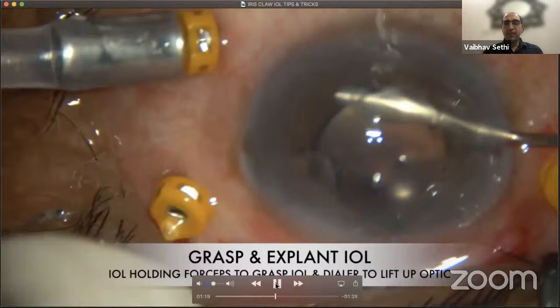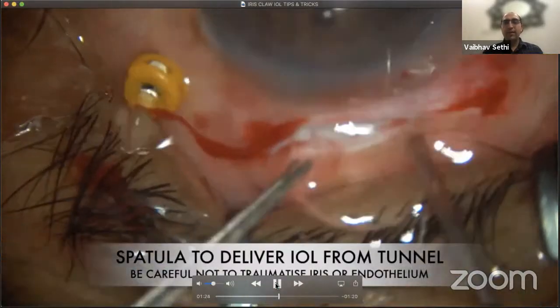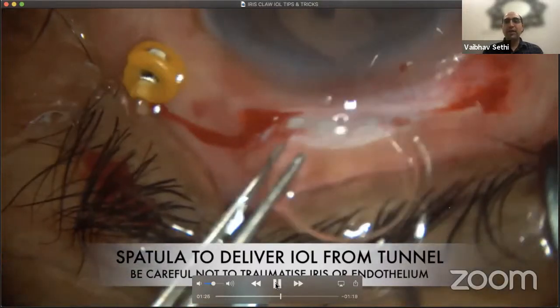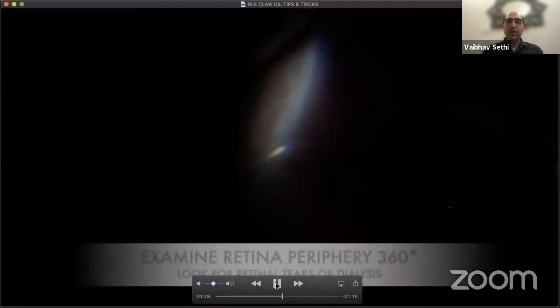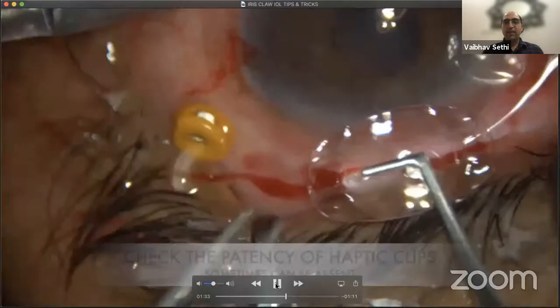chamber. Here's another area where people make mistakes, because even I do the same thing sometimes. When you're in a hurry to deliver the IOL out, you forget that the trailing haptic is stuck to the iris, basically looping the iris margin. If you pull it too much, you can cause iris dialysis, and then placing an iris fixated IOL or your SFIOL becomes difficult. So avoid that. Be careful that you deliver it properly and curve it around. It's very important to check the periphery.